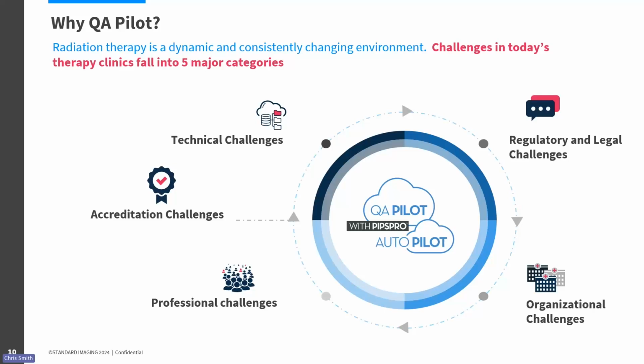So it's really important to think, rather than see these sort of features that are right in front of you in terms of QA Pilot, rather think what's not here. What won't you see in the actual software itself? Because those customization opportunities and the tailored hands-on approach we take with you is really the power of what we can do, not only to be a consultant, but also help you think through your workflows and how we can be more efficient. And Standard Imaging specializes in our physics-based approach, and we can certainly help you on those efforts, right?